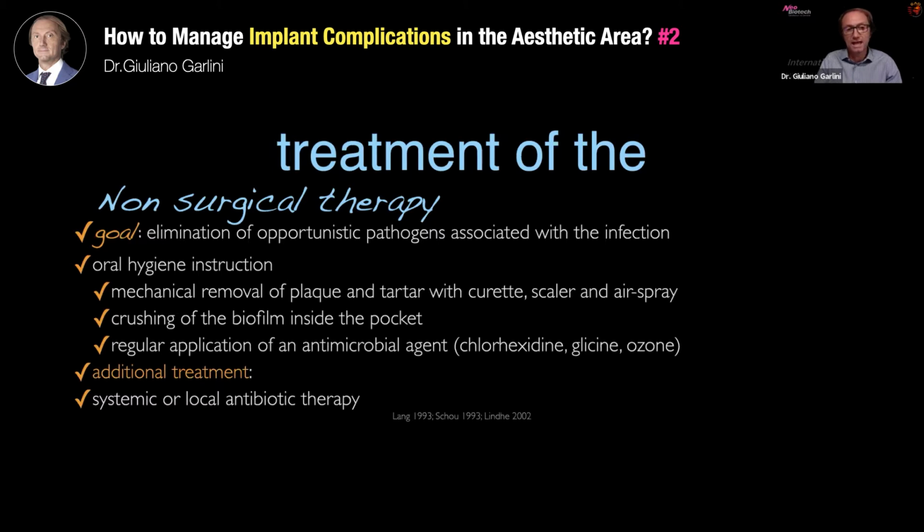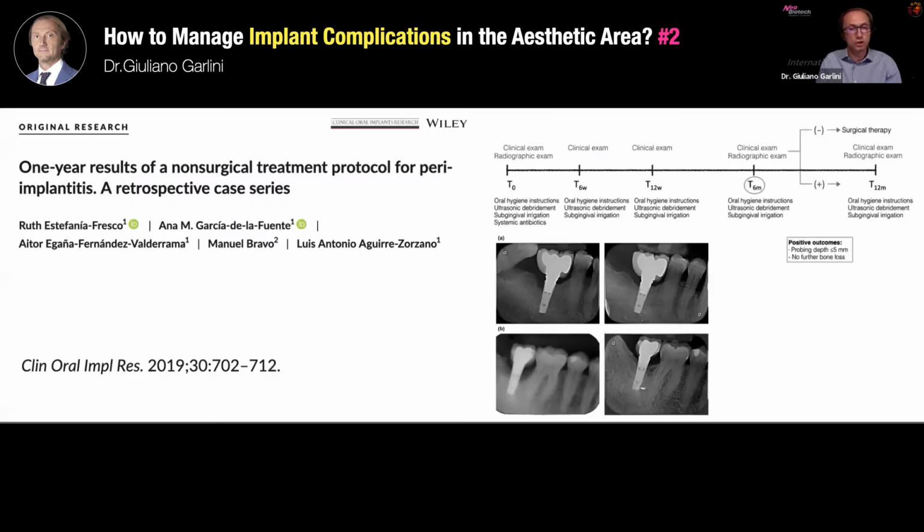Once again, the goal of this therapy will be the elimination of the opportunistic pathogens associated with infection, and to detoxify once again the surface of the implant with a mechanical removal of plaque and tartar with a correct scaler, and we will see in a very few minutes some special rotating instruments that can help you do this. So the first approach will be a non-surgical approach.